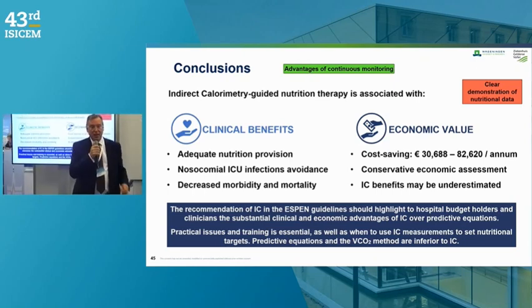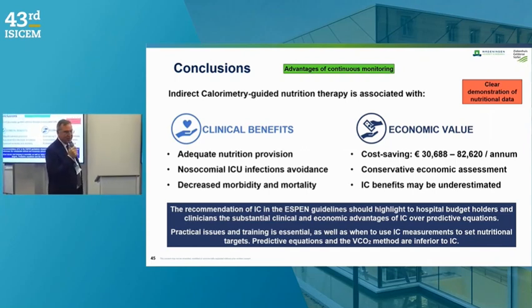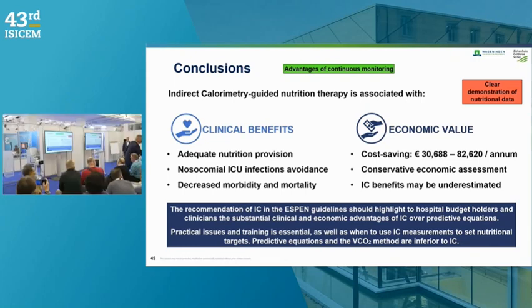It can happen. What I do is I measure the RQ in the patient. It's available from the device. And I always watch the reading. Sometimes you have an RQ of 0.49. What does it tell you? The patient needs glucose.